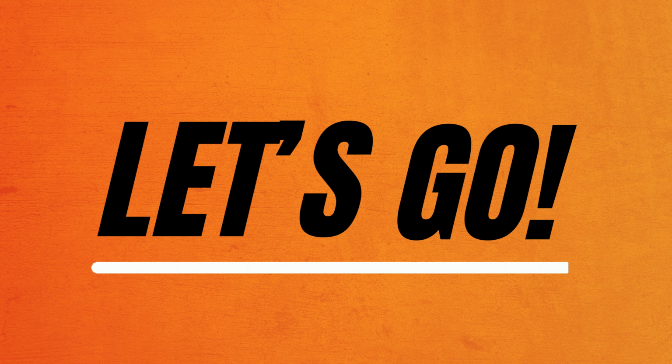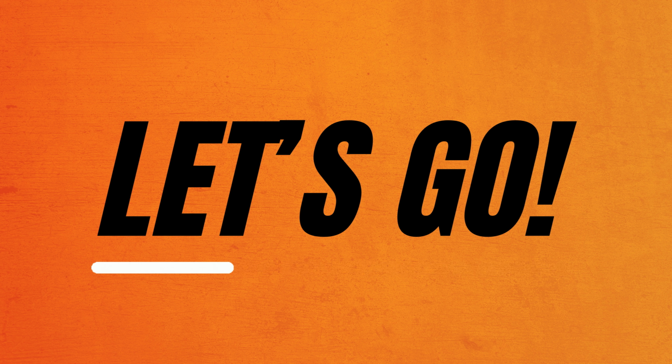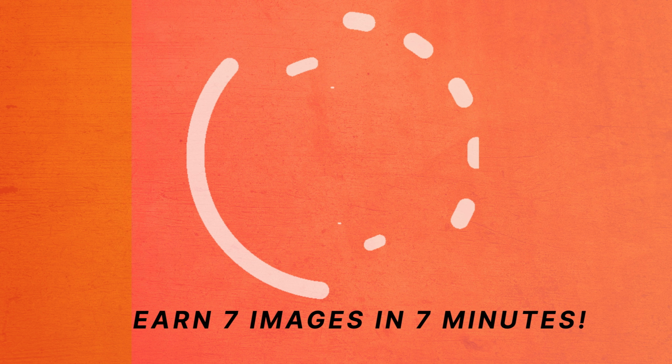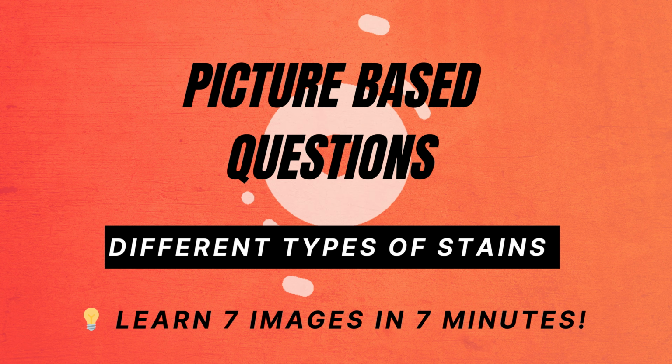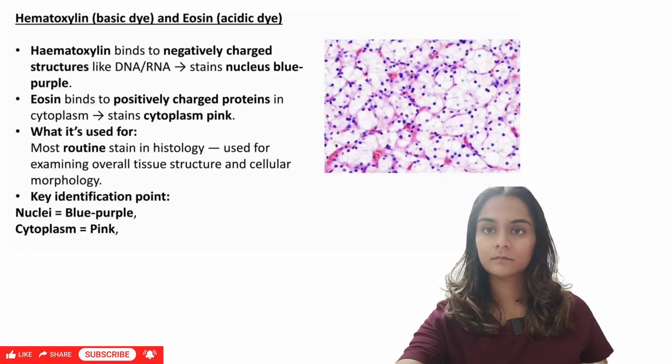Hello everyone. If you're a first year medical student, you know how confusing it can get to identify histology stains during practical exams. In this video, I will break down 7 of the most important stains you must know and show you exactly how to identify each one in a slide. I will keep it super simple, just the name, key color clues, what the stain highlights and how to tell it apart from others. So let's make stain spotting easy and exam ready.